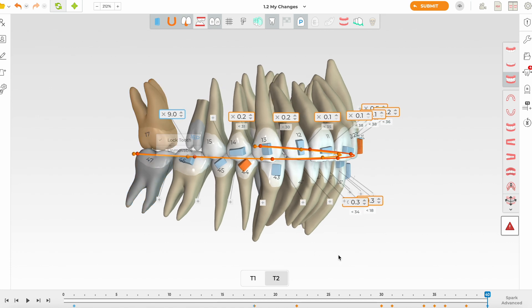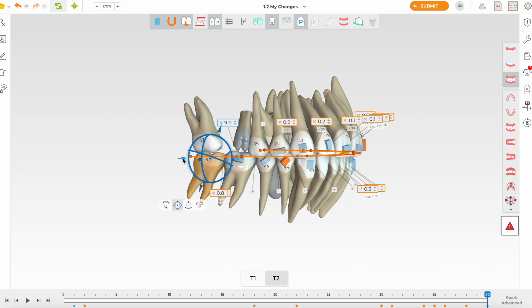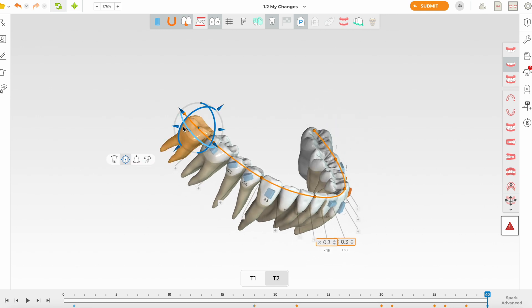Checking that it's not in crossbite — it's a little too expanded. We'll move it lingually and it probably needs a bit more buccal movement. I'll unlock it again and move it buccally so we don't end up in a crossbite. Looking from the side, that's better. The lower 7 also needs some lingual and possibly distal movement.